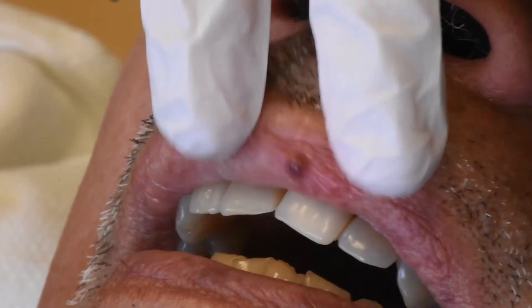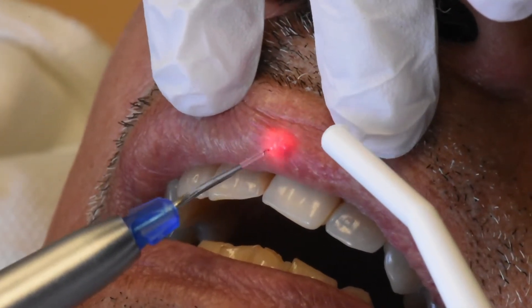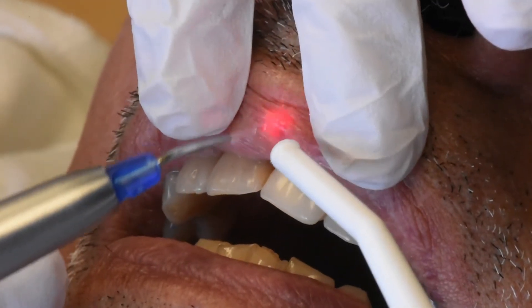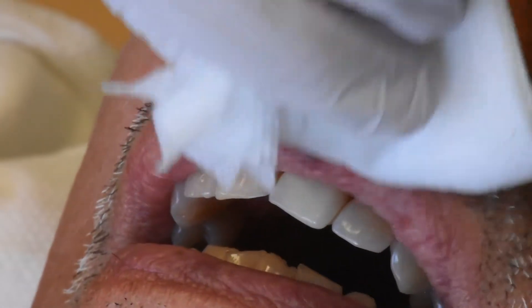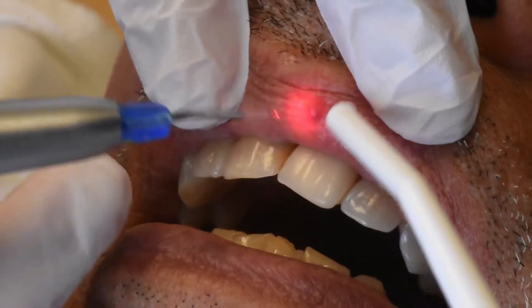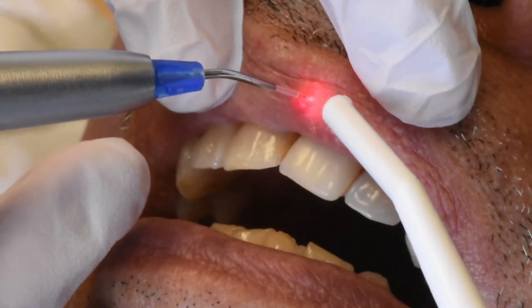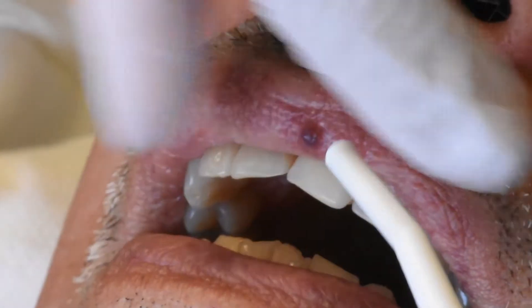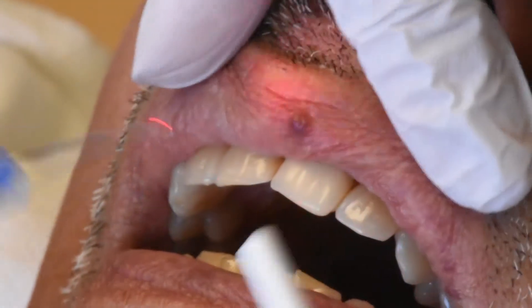Typically we see it turning a little bit wider. Once in a while we can put a cool compress here with a little moisture. It's already smaller in size because we shrunk it.